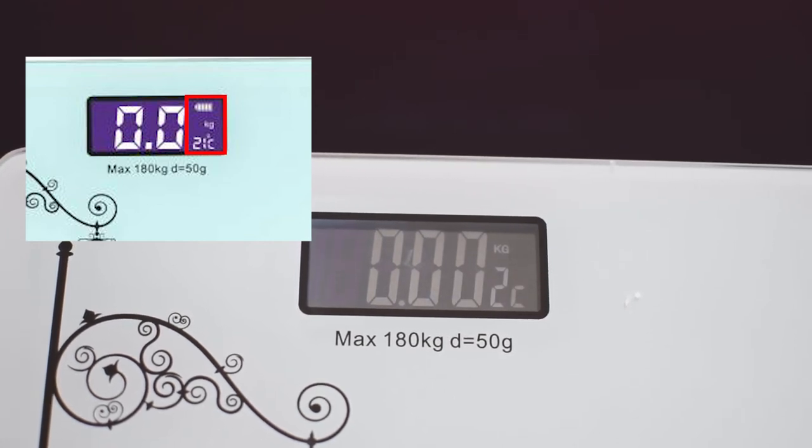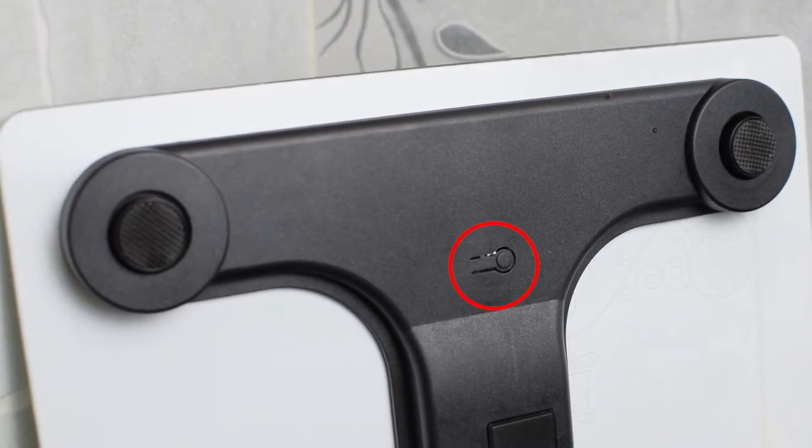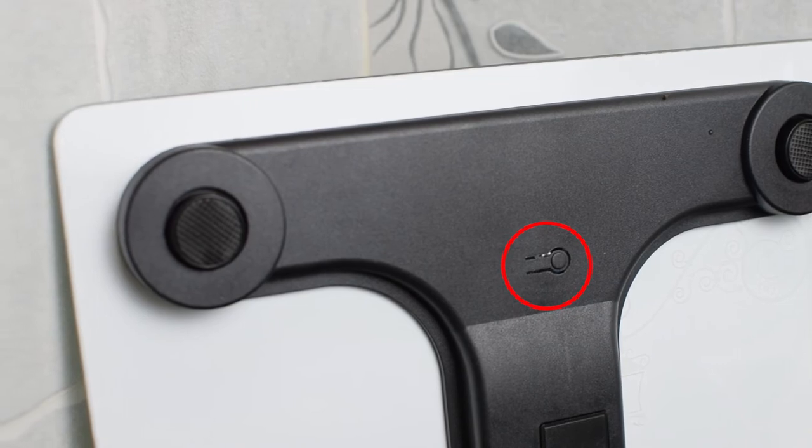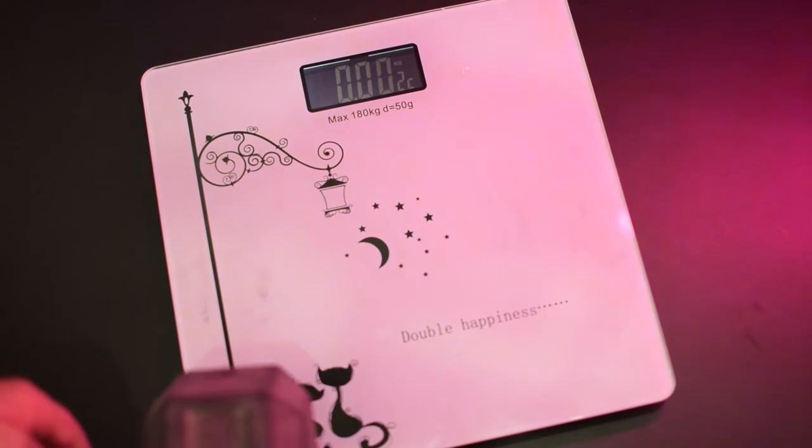At the back there is a toggle button that is used to change the units of measurement. Now let's check the accuracy of this scale by using different weights.